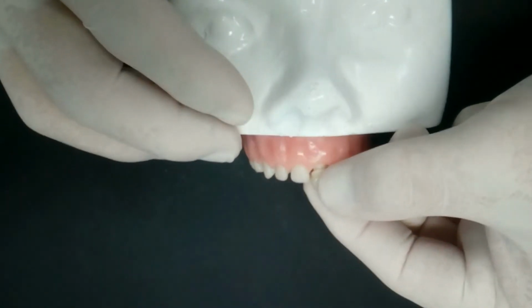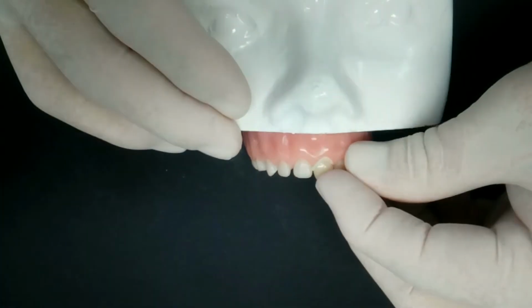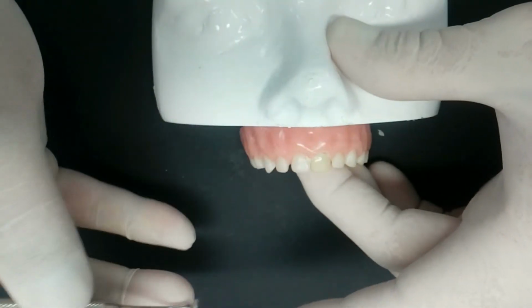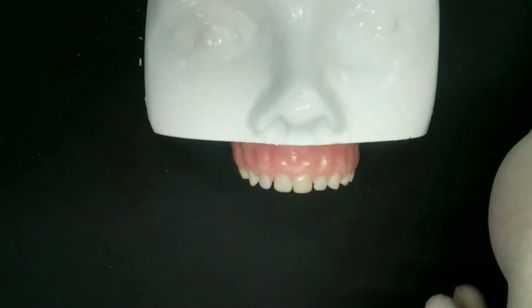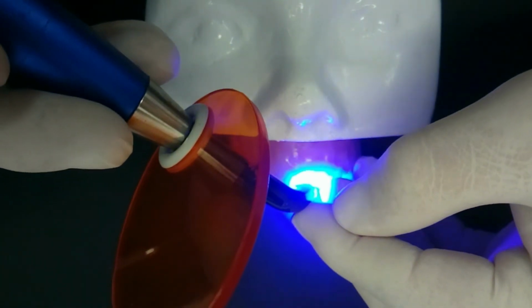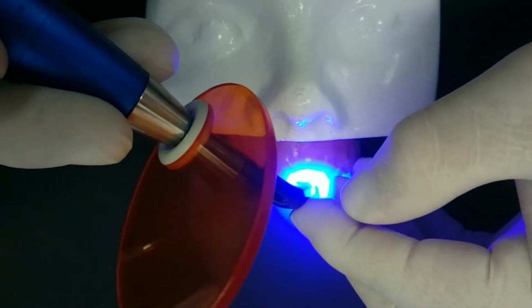We place the crown on the stump and cement it slowly, leaving the surplus resin to drain. With the IPC instrument, we remove the surplus. We apply the light of the photopolymerization lamp to solidify the cementing resin. The resin has the property of chemically integrating both the crown and the bonding agent with which the stump was covered, and solidifies by the effect of this intense blue light.